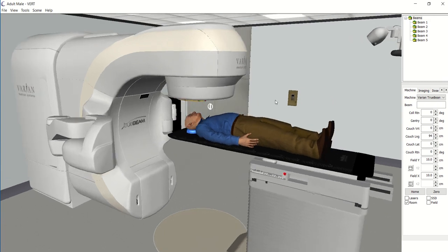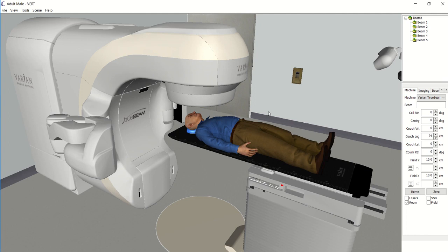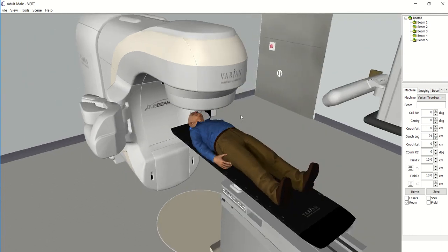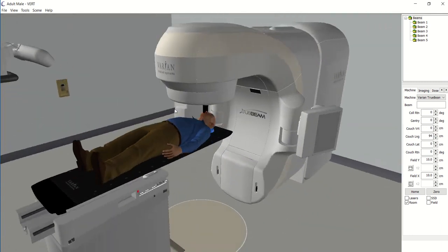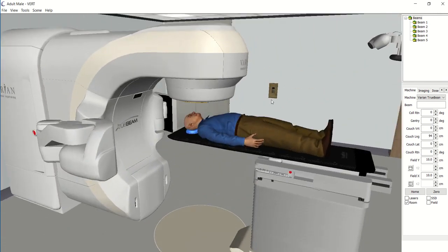Before we dive into it, at the time of recording we are all working from home, so don't be alarmed if you hear a small child yelling — that's normal. What I'm showing you here is our version of VRT on a laptop, which we can take to hospital visits or open days. At the university we have a whole room dedicated to VRT, and this screen is actually projected onto an entire wall, so it is very immersive. We also have all the hand pendants and controls that they use within the hospitals, so you can have a practice using them before you even go out onto your first placement.